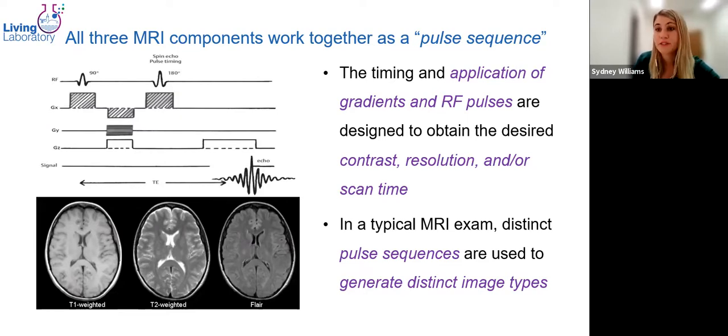And that might have a different meaning for a particular diagnostic assessment. For example, on the left, this is what we call a T1 weighted image, and then a different type of contrast in the center, T2 weighted. And then on the far right, it's called a FLAIR, which is used to suppress any signal that we get from the fluid in our brain and just show tissue.